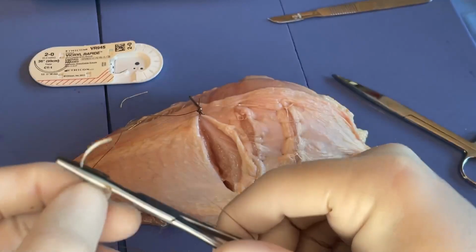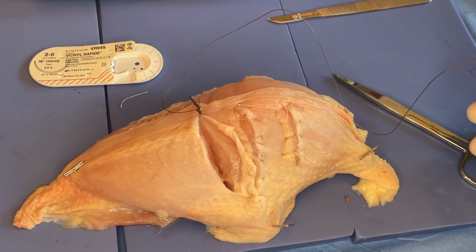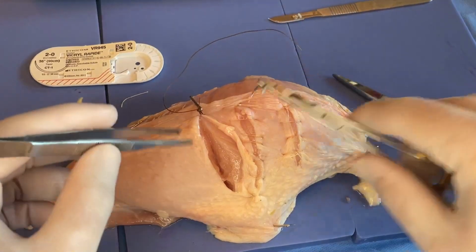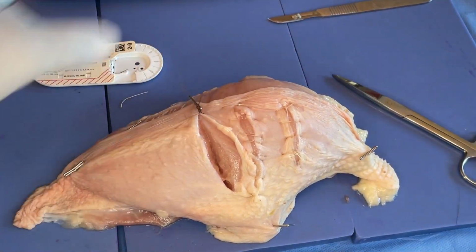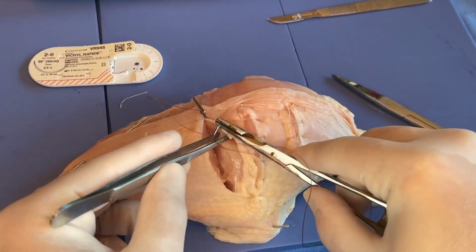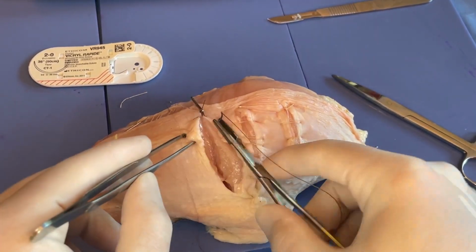All right. So running interlocking. We do this most commonly on the uterus because we need good hemostasis along the hysterotomy. Oftentimes, most of the time, we'll have our assistant who's holding the end here following us. So down through the tissue, come out in the middle. We're going to do this across in one bite.